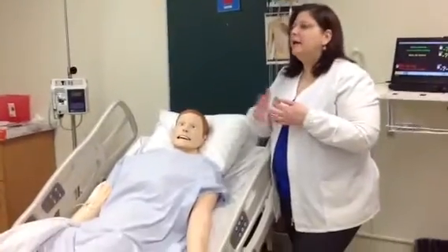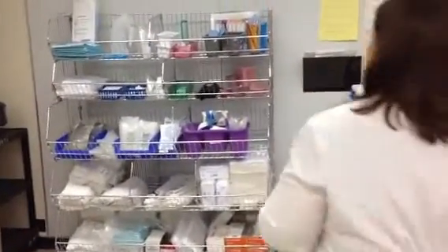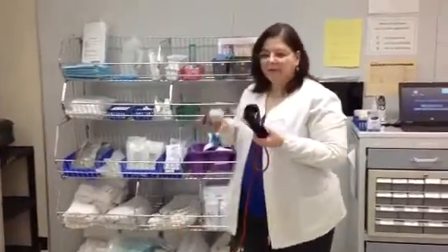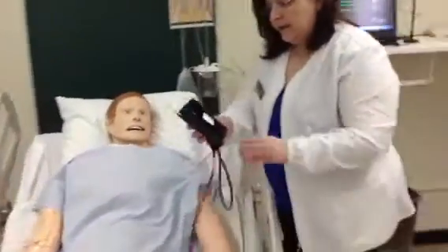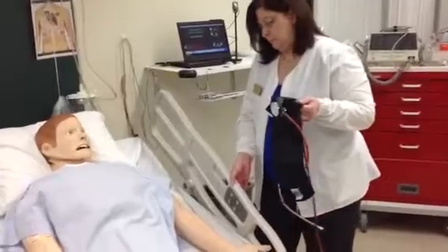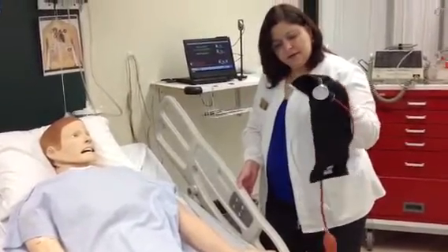Vital signs. Over on the cart, if I'm going to give vital signs on SimMan, I'm going to grab my blood pressure cuff and my thermometer. And put my blood pressure cuff on. There is an extra tube here.